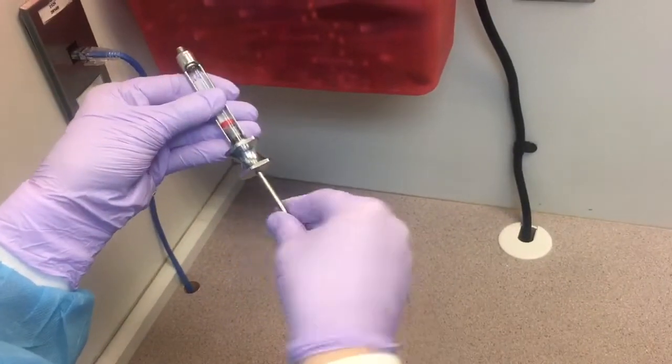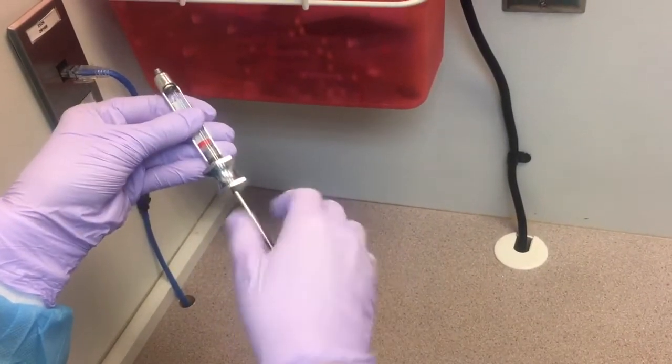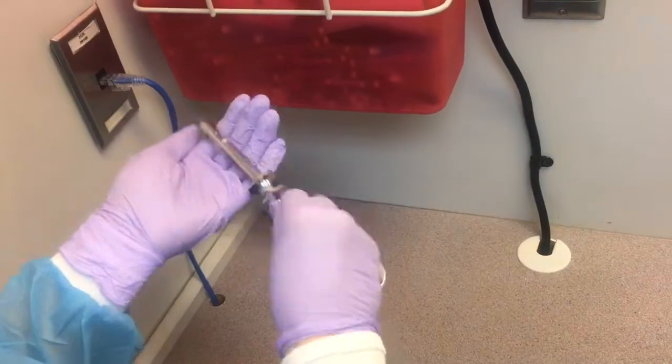Hold on to the anesthetic cartridge and twist until the harpoon becomes disengaged from the plunger. Remove the cartridge and throw it in the sharps container.